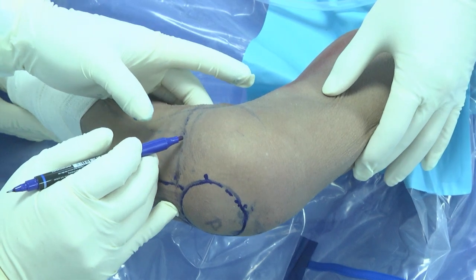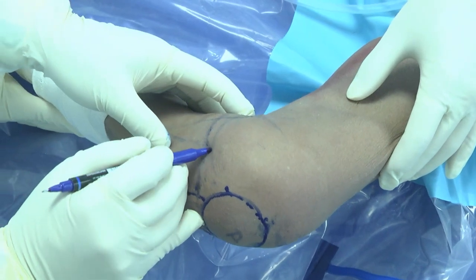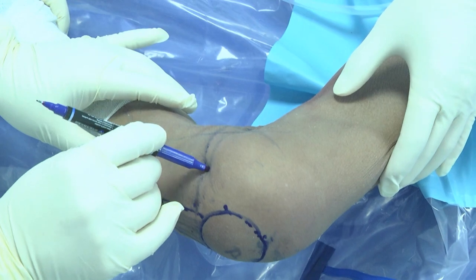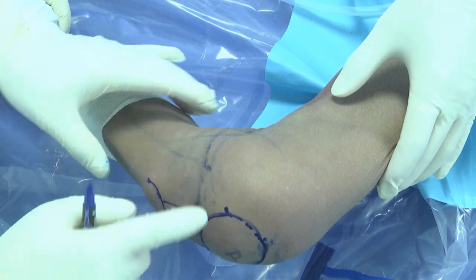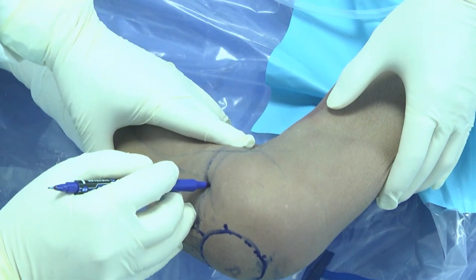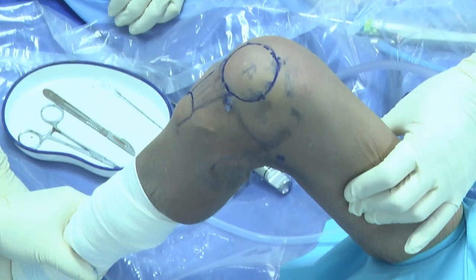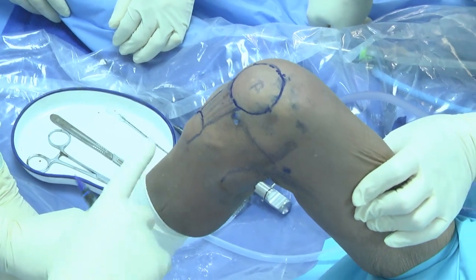Okay, that is another portal. If you want to do a meniscus root repair, I will have another portal here. We call it the mid-medial portal. We can show you later how to make this, but we need to look from inside. It's approximately midway between front and back. This is the mid-medial portal for meniscus root repair. I also set it using the scope inside the joint, transilluminating through the skin.